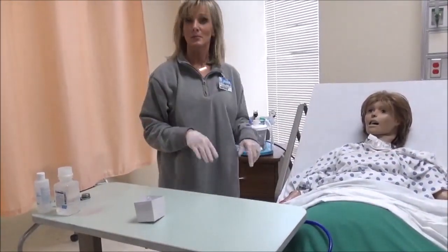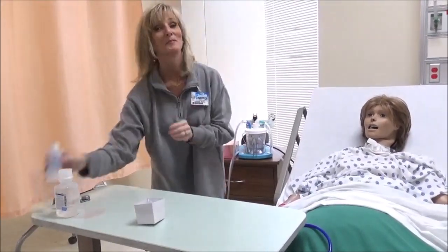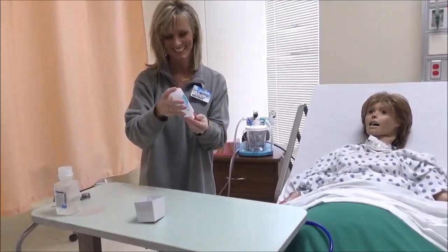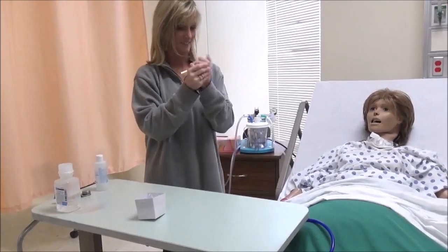And go and document my procedure. Take my gloves off and perform hand hygiene before I leave my client's room.